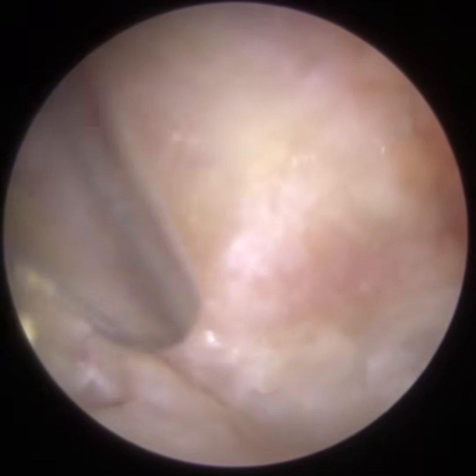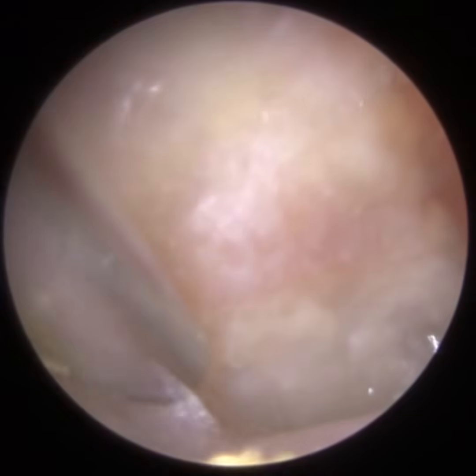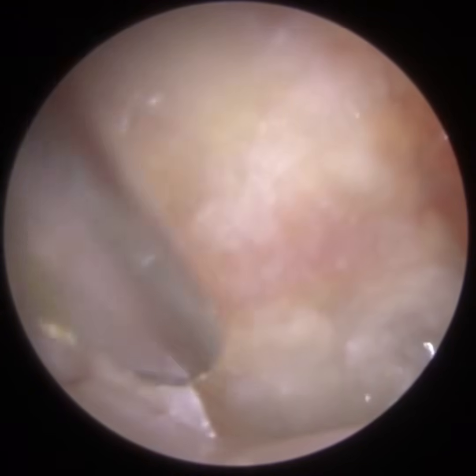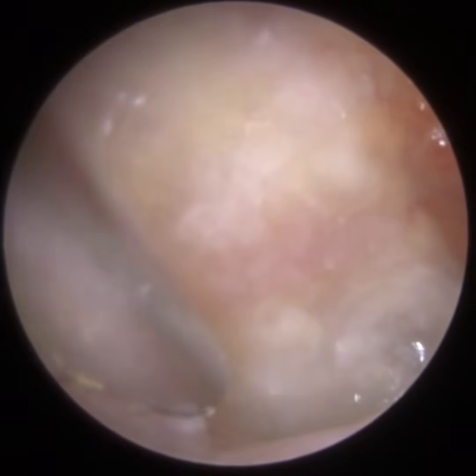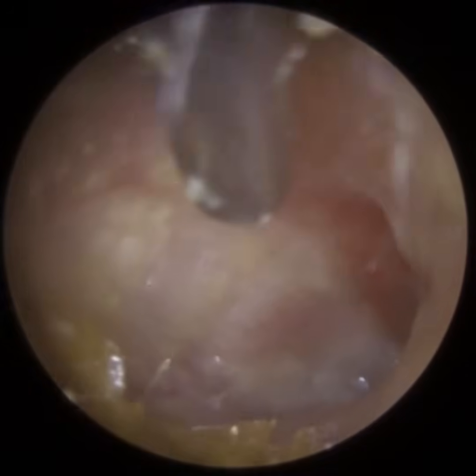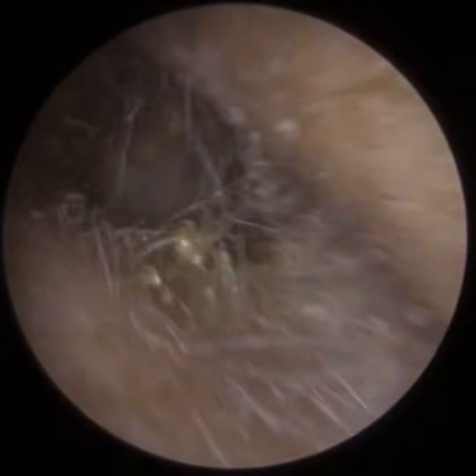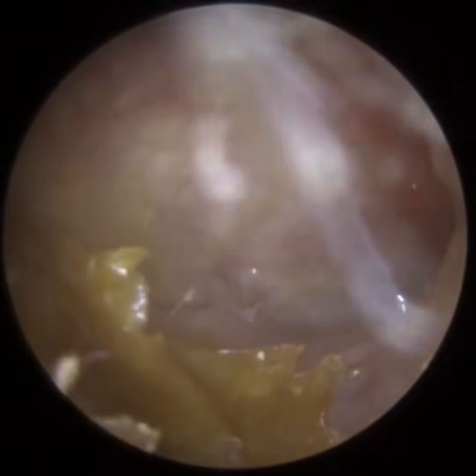Because the patient has got a narrow ear canal, it sometimes can be difficult to manoeuvre the suction probe because there's limited space once we're in the ear. The patient has also got a very prominent inferior recess. Most people's ear canals incline upwards around 30 degrees. So we've got an upward slope, and then about 0.5 centimetre away from the eardrum, the ear canal narrows and it protrudes back out again.